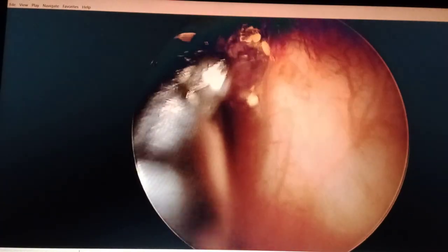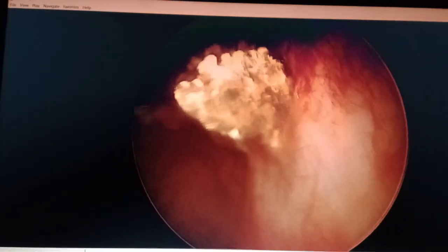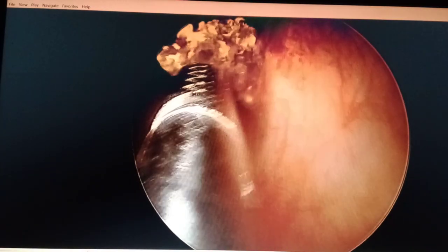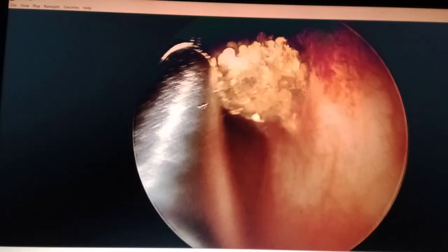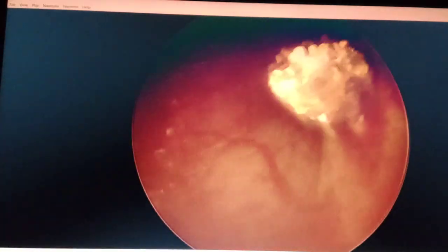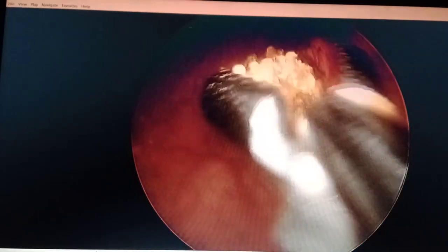What I am doing here is using a stent-removing forcep to slightly debulk the stone — specifically the part of the stone that is projecting inside the urinary bladder lumen — by mechanically applying a slight rotatory force after holding the projecting part, and just slightly trying to mobilize it to create a space between the ureter-vesicle junction wall and the stone.